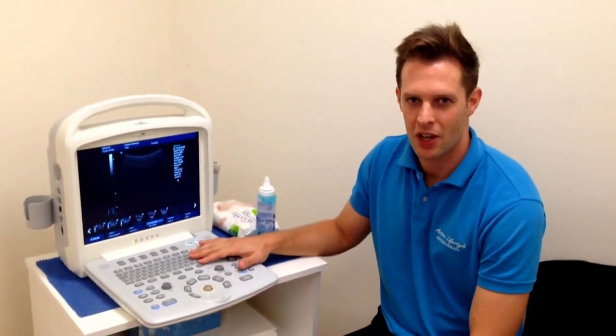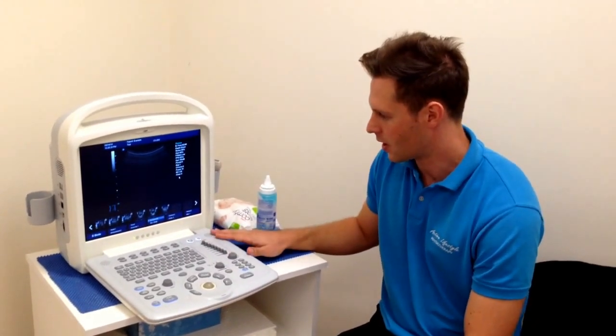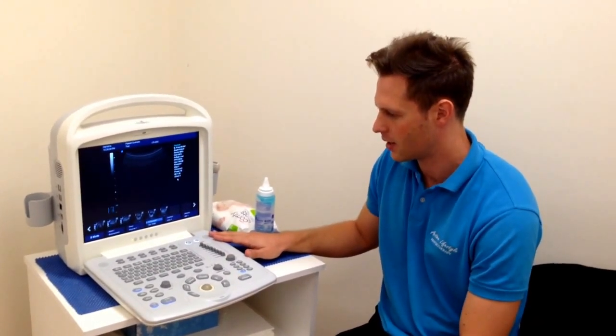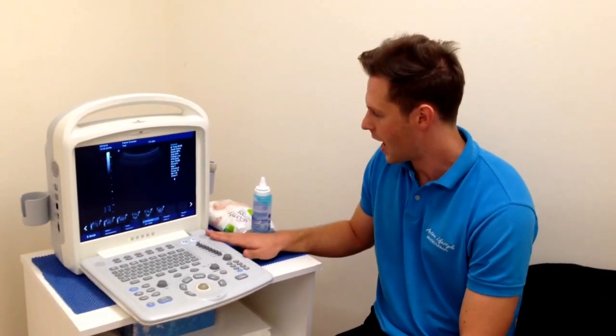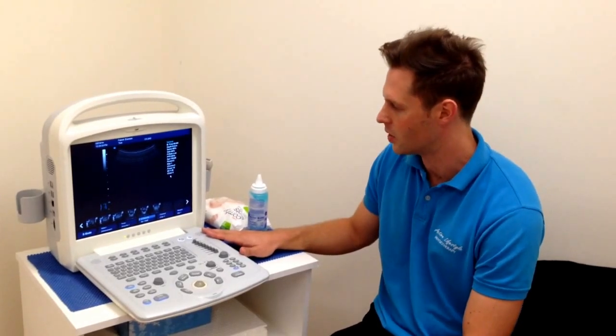My name's Stuart, I'm a physio. I've been using a real-time ultrasound machine in our physio practice for the last few years. What we're going to do is just talk quickly about the ultrasound machine itself, the type of probes that we use with physiotherapy, and some of the functions that we need to get familiar with.